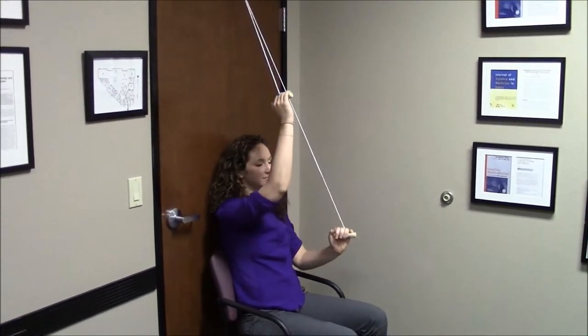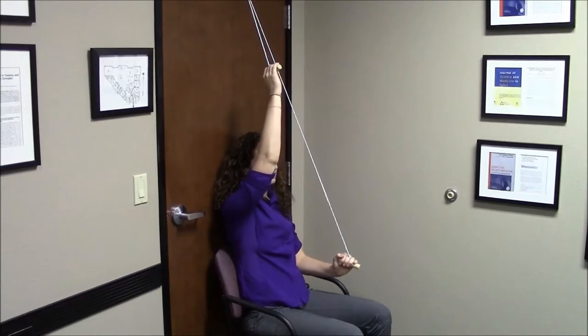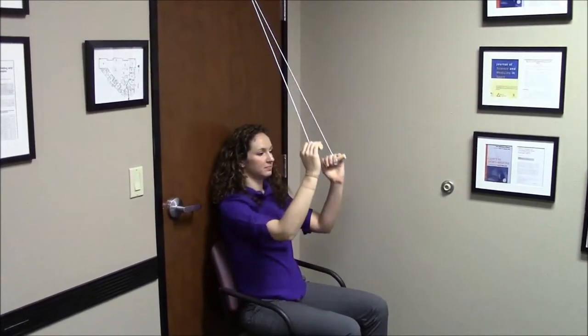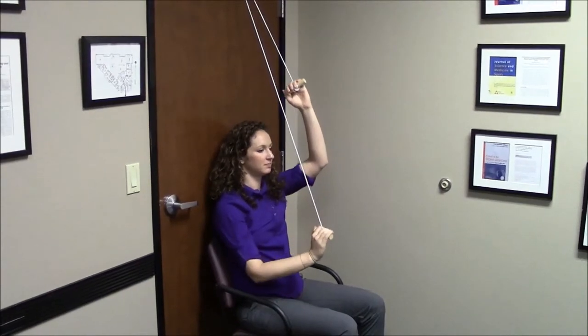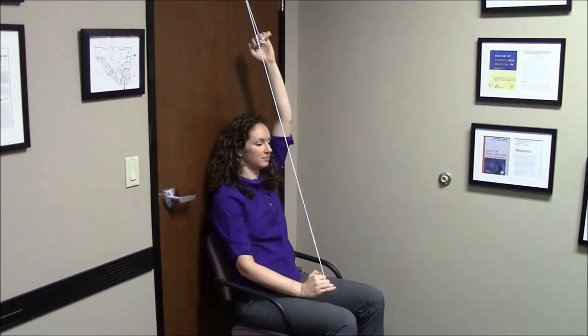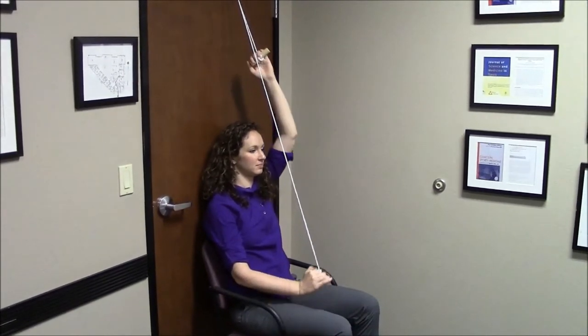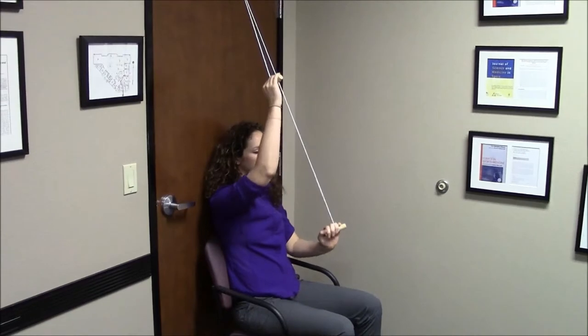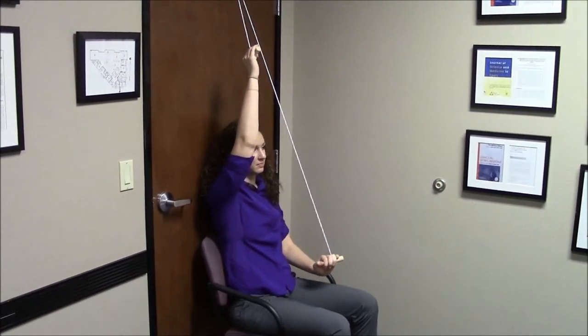As you progress in your range of motion with the pulley, face with your back towards the door to increase the range of motion performed during the pulley exercise. As you see in this video, pause at the top of the range of motion with your injured arm to optimize the amount of stretching in your shoulder.